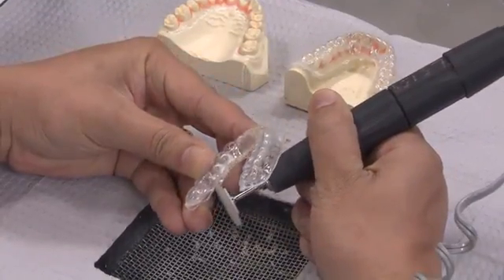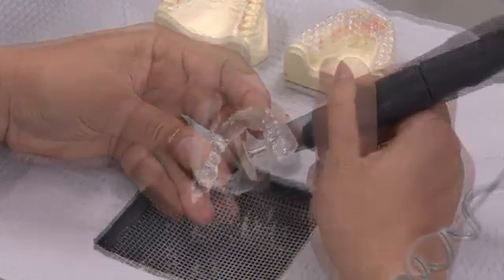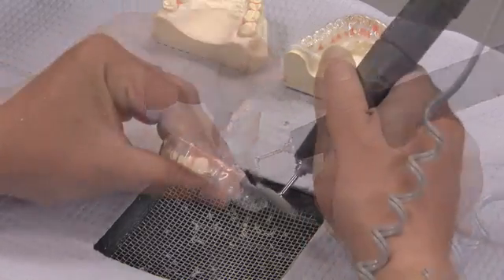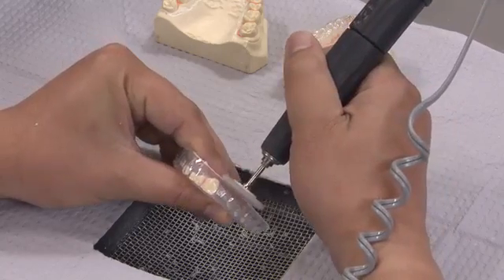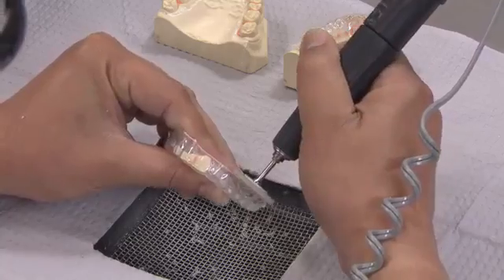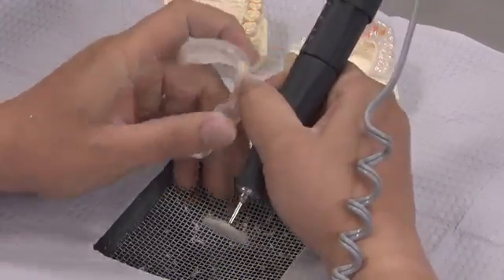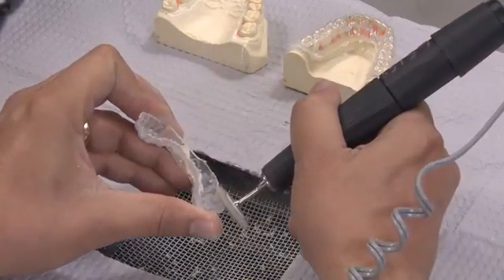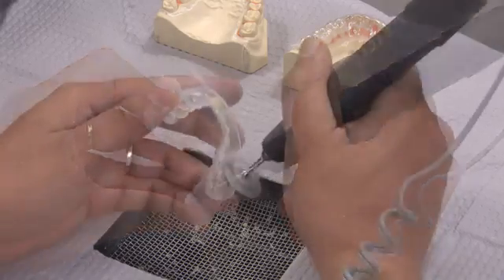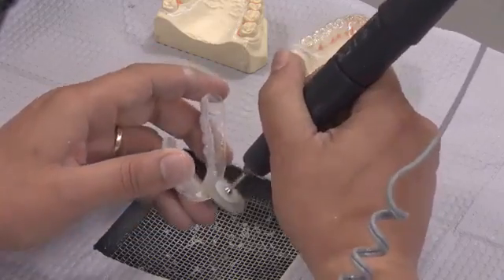Using a brown Lisco disc, do bulk reshaping along the tissue edge of the device. On the lingual, follow the shape of the initial cut. On the facial, try to get the device as flat as possible, staying about 2 mm away from the teeth. Next, go over the edges of the appliance and slightly round the edges.